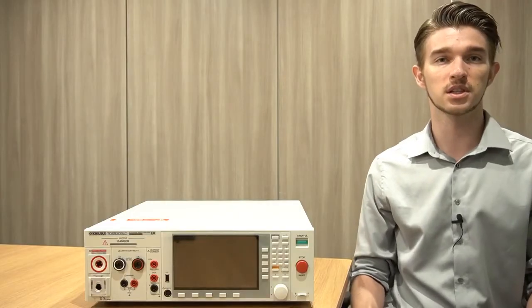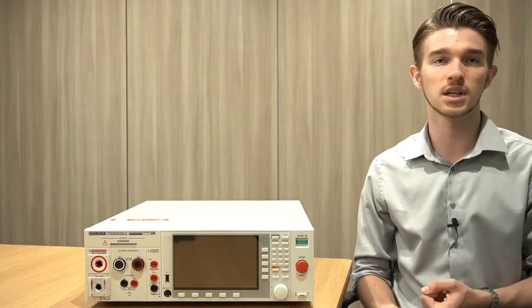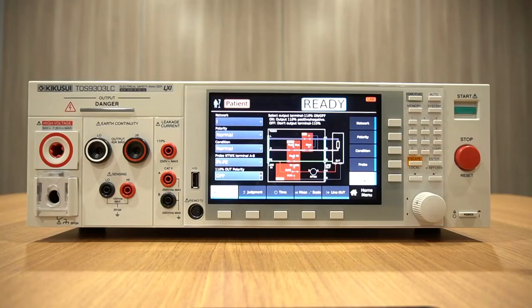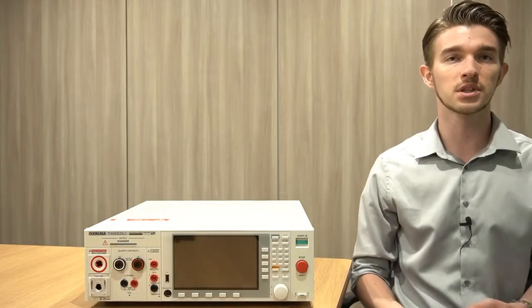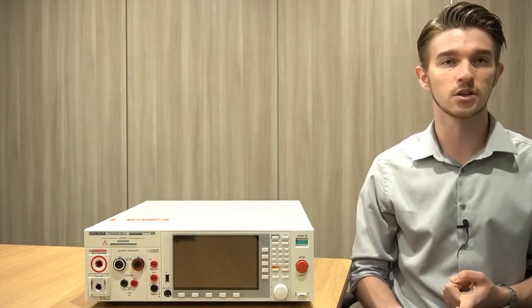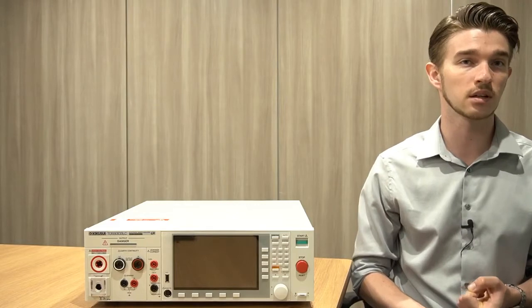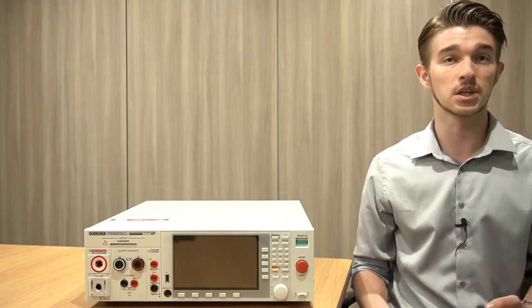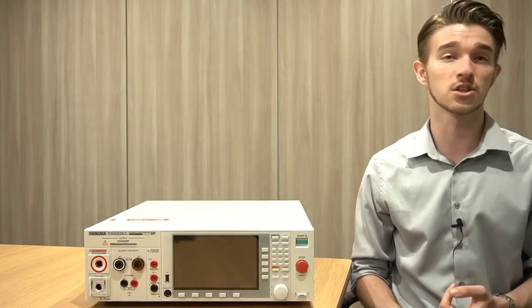60601-1. Patient current specific settings, such as 110% of the DUT rating, can be accessed by pressing Connection and 110% Out. From here, you can simply switch this setting on to apply 110% of the DUT's rating in either a positive or negative polarity.